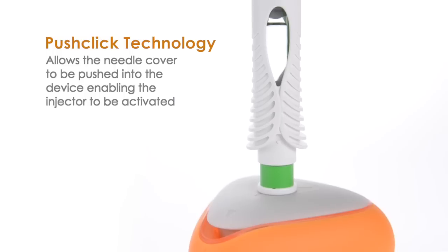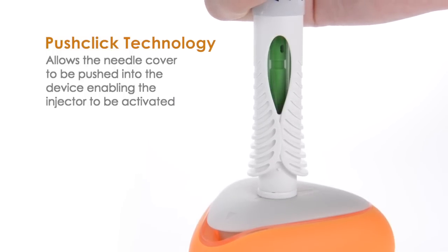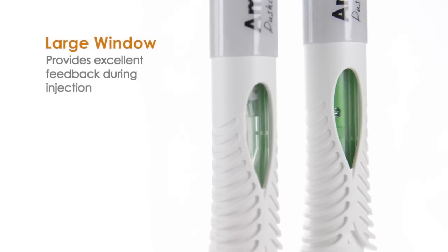Push-click technology allows the needle cover to be pushed into the device, enabling the injector to be activated. The large viewing window provides excellent feedback during injection.